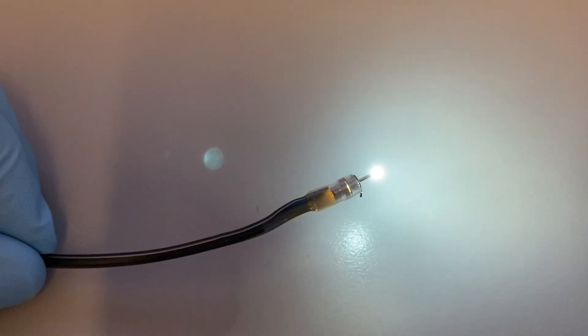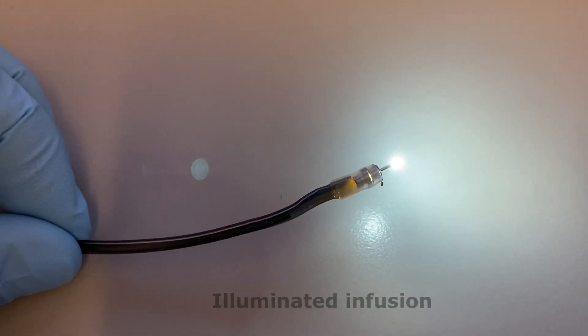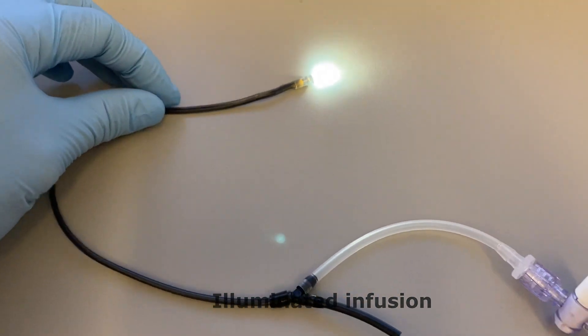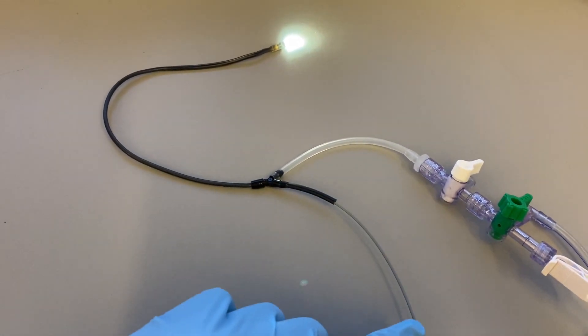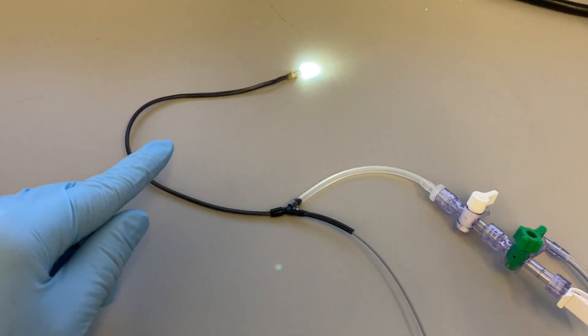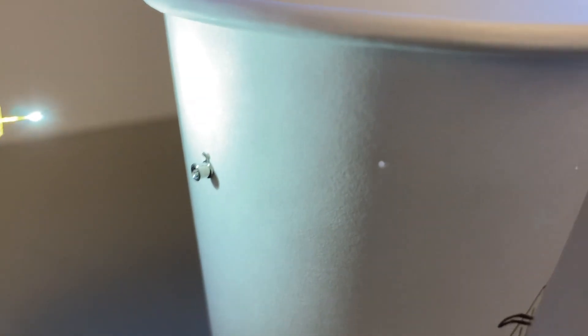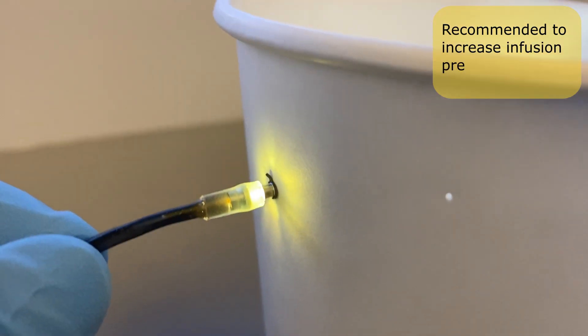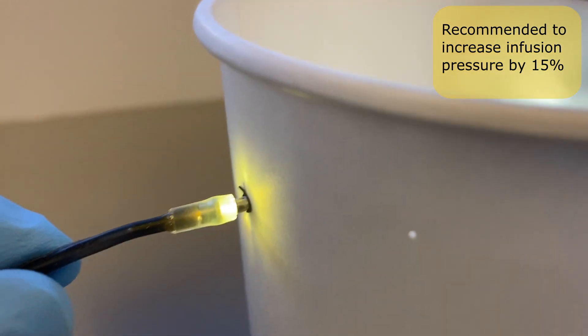Another example of a stationary light system is an illuminated infusion. The illuminated infusion system consists of optic fiber connected to the infusion line. It can be inserted into a regular scleral cannula. Because the fiber optic competes for space with the infusion line, it is recommended to increase infusion pressure by 15% to achieve the desired pressure ranges inside the eye.